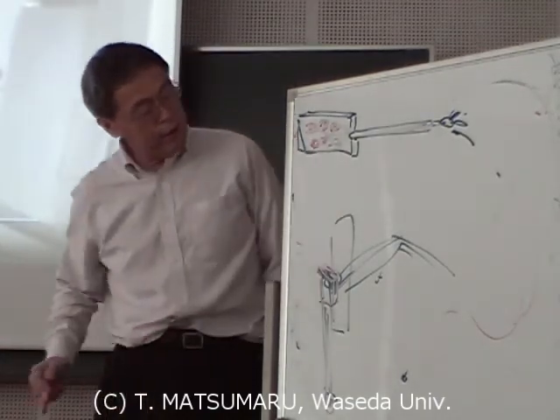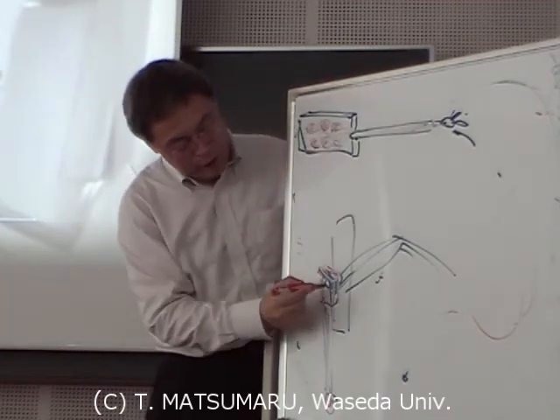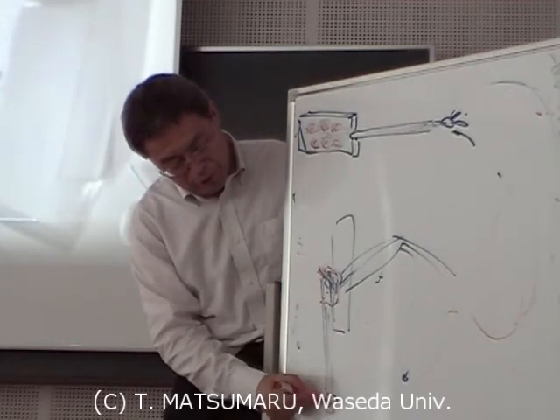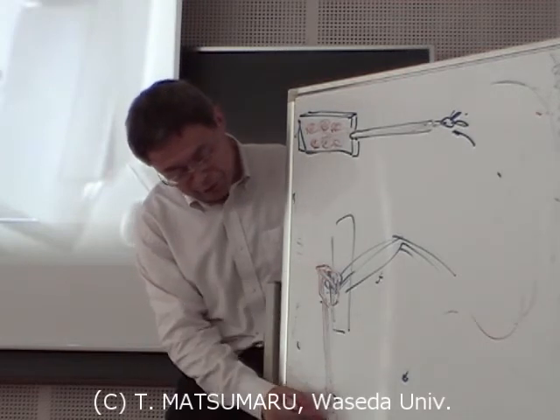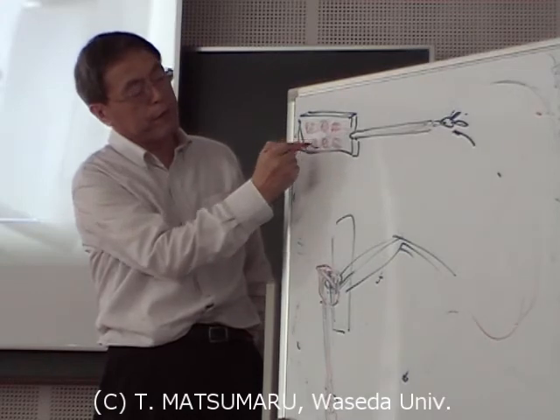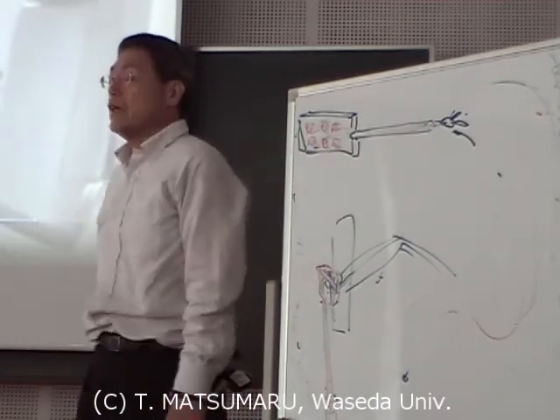Why is this system necessary? It makes it easy to connect the driving part, so that driving force is transferred into these tools easily by using this system.